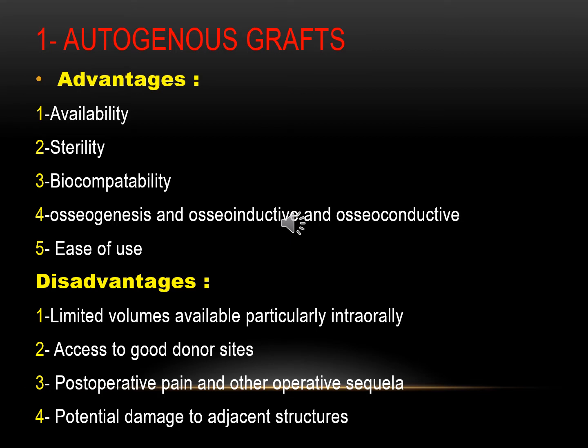What about the disadvantages of the autogenous bone graft? One, limited volumes available, particularly intraorally. When we have a huge bone defect, that means we need a huge quantity of bone graft, which is difficult to make available intraorally, and in this case we need an extraoral donor site.